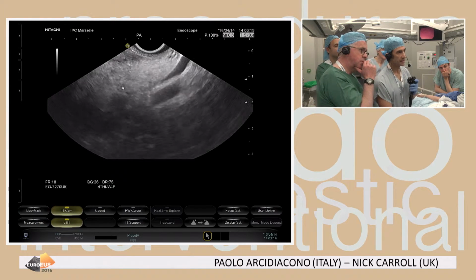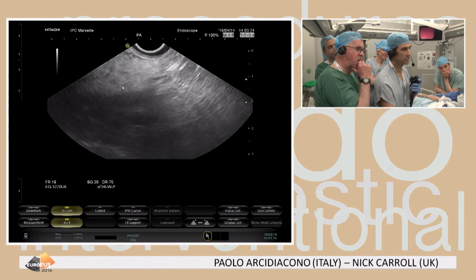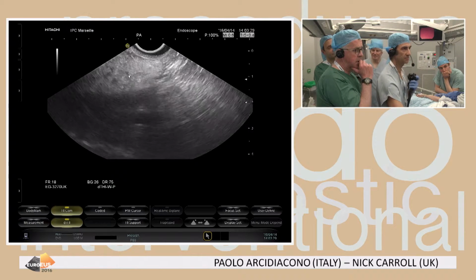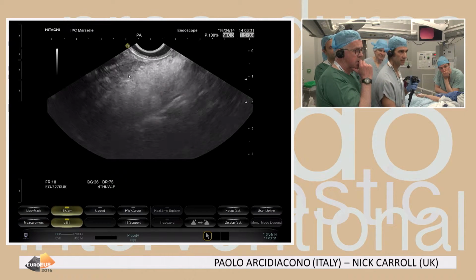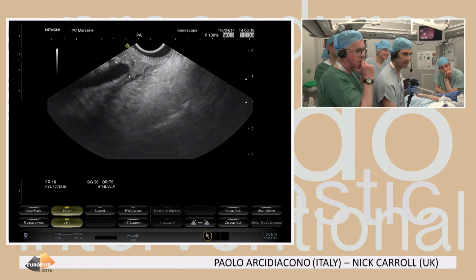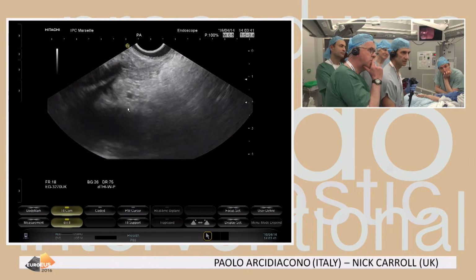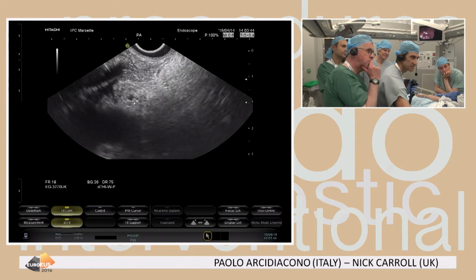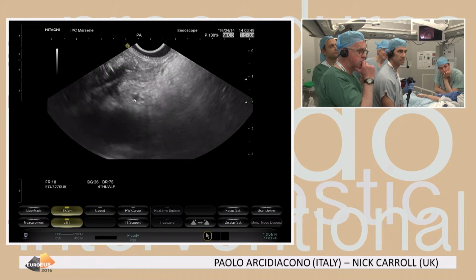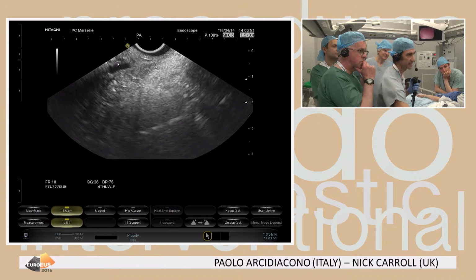I don't know. But for sure in this area there are no big lesions. We have some collateral duct here from the dorsal duct, and also if we look at the ventral duct, probably we can see a collateral going down here, and there is a very tiny cyst here, along this collateral duct of the ventral duct, and this is the common bile duct.